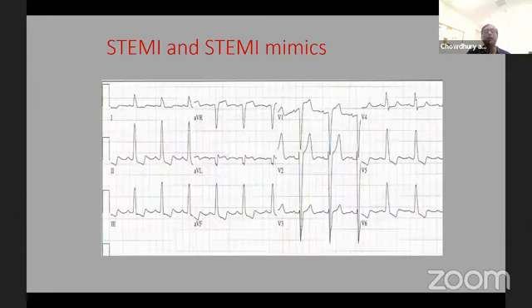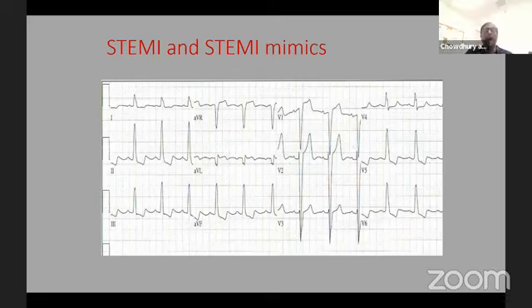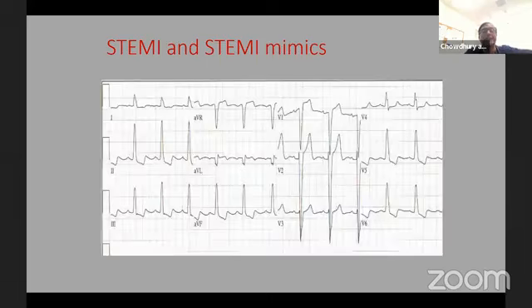STEMI or no STEMI? But this one I like as STEMI. STEMI mimics, looks like. Yes. So I think we should learn ourselves and make our brains get used to this. Yes, there is ST elevation. What is the clinical picture? A 27-year-old with fever. Pericarditis. Thank you. What is this?